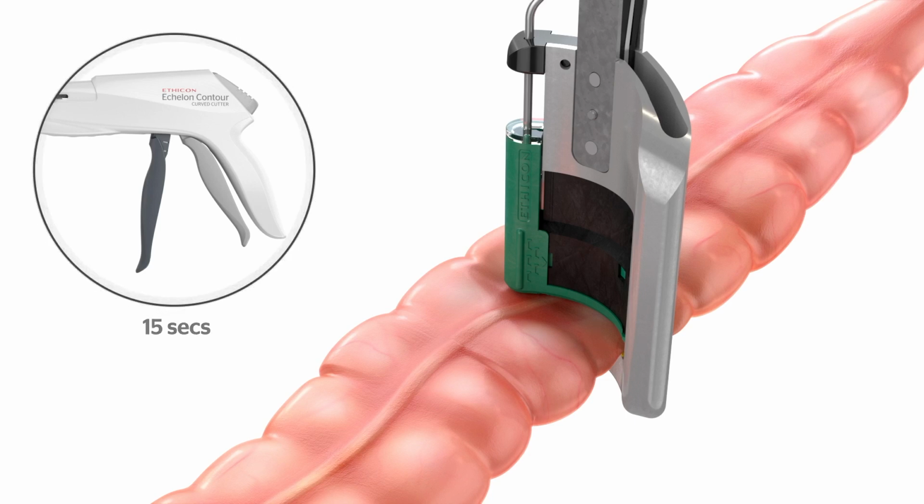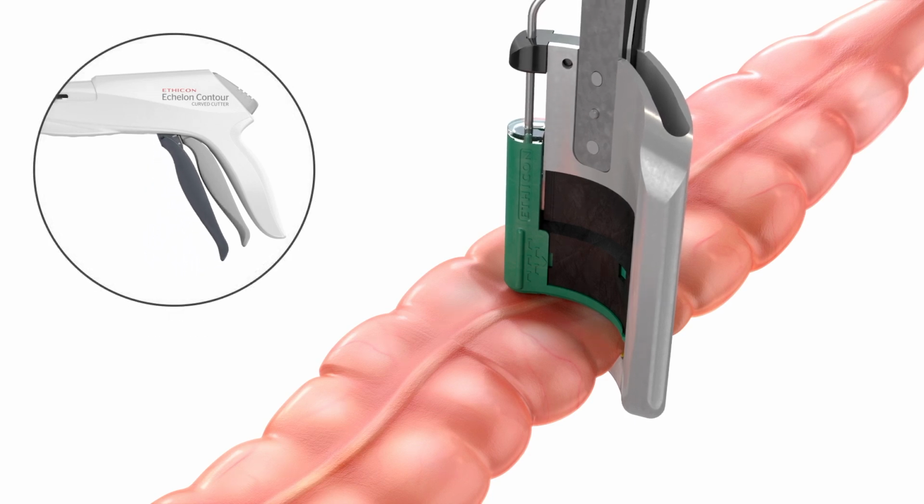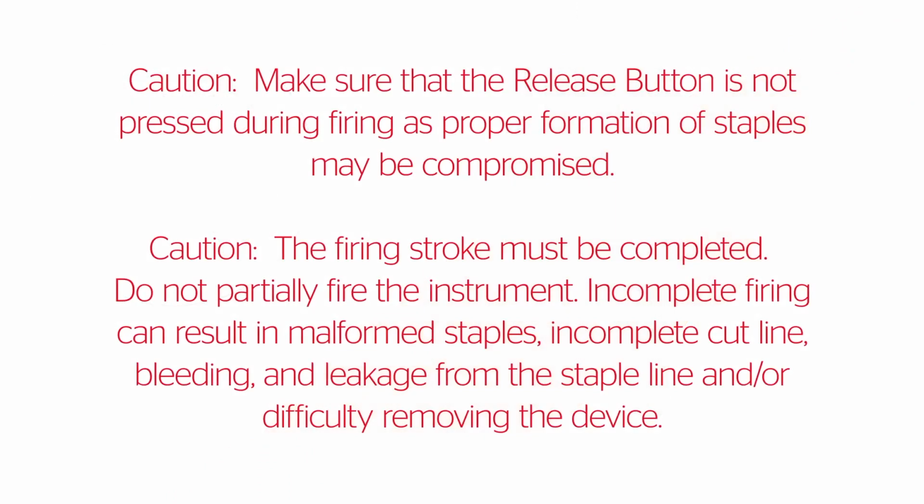Completely fire the instrument by squeezing the firing trigger until it touches the closure trigger. Make sure that the release button is not pressed during firing, as proper formation of staples may be compromised. The firing stroke must be completed. Do not partially fire the instrument.